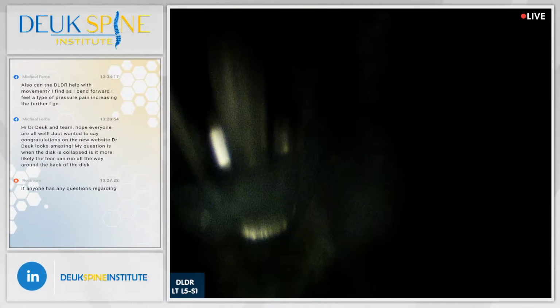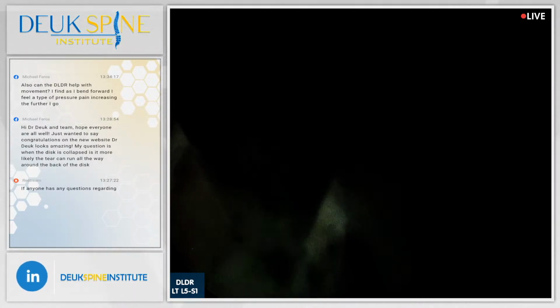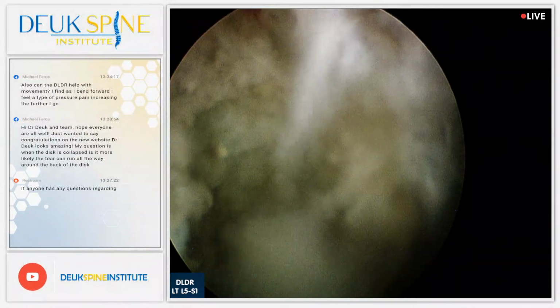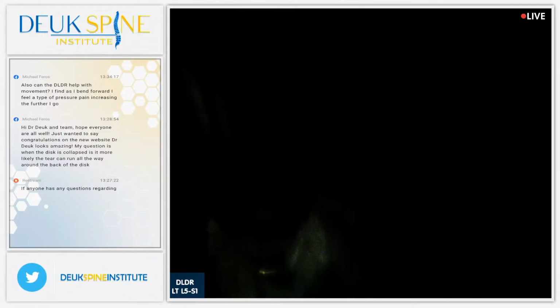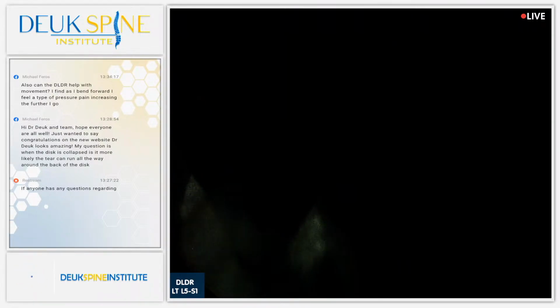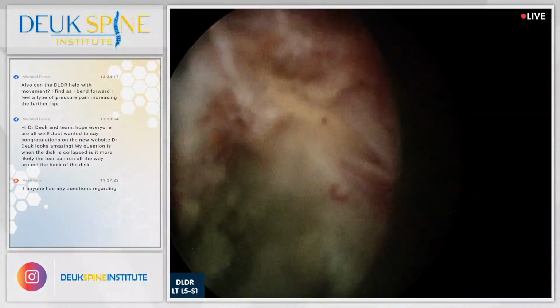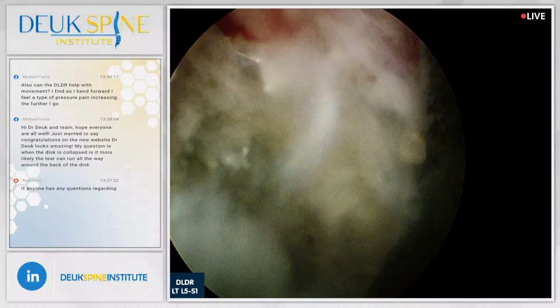And if you have a fractured vertebrae, which you probably don't have, but that would be painful when you bend forward as well. All right, almost done. I have about a minute left. We'll take some more question and answer if there are more questions. Otherwise, I'm just going to keep trying to remove as much of this herniation as I can. And what I tell this patient, and I tell every patient, we will never get all of your herniation out. It is impossible. You cannot remove 100% of a herniation.